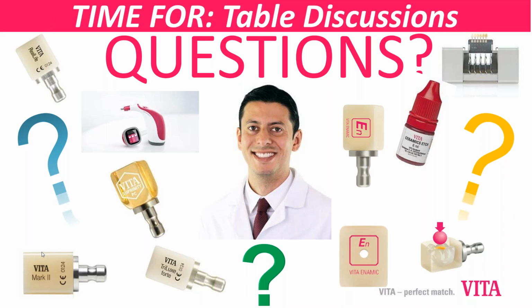Okay. So we have another question: does a finishing agent leave a cloudier glaze finish? It's not cloudier. I think it's pearl, I would say. I think it's a thinner layer that penetrates very nicely and seals the restoration without losing the texture.